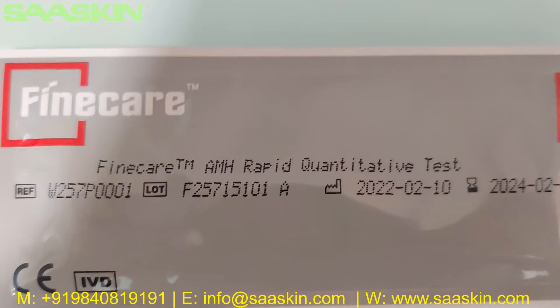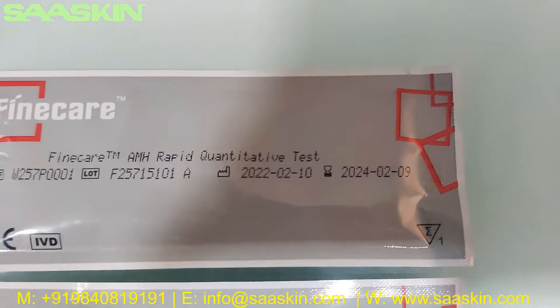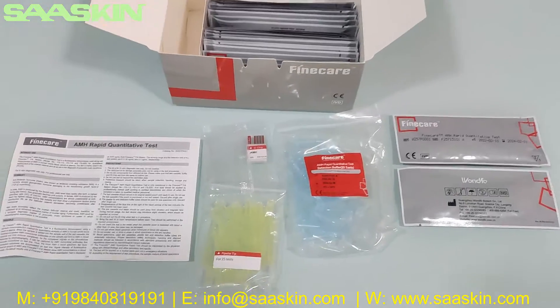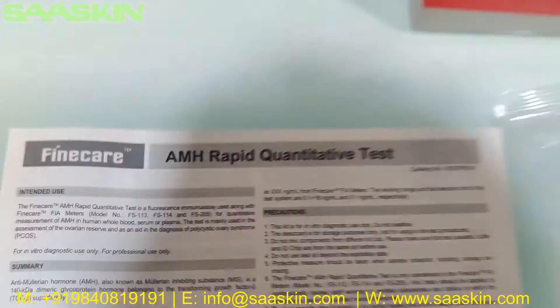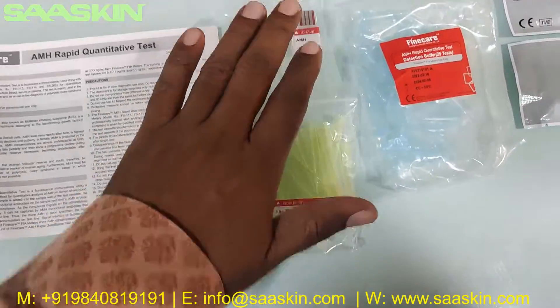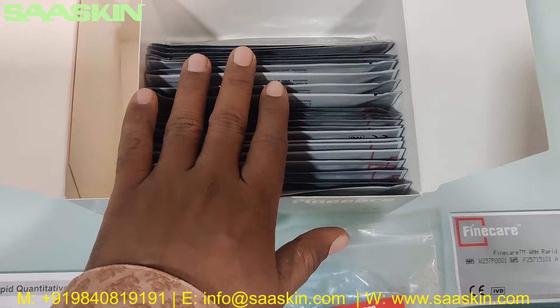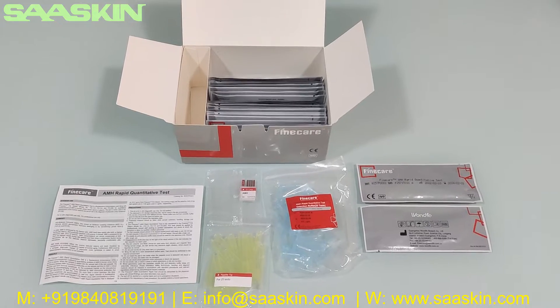You can see it says Fine Care AMH Rapid Quantitative Test with the reference number, lot number, expiry period — single test kit pack. So to summarize: it is a 25-test kit pack, and in each pack you get one instruction for use manual, one ID chip, 25 pipette tips, 25 detection buffers, and 25 test cartridges. That's the summary of the unboxing. Thank you.